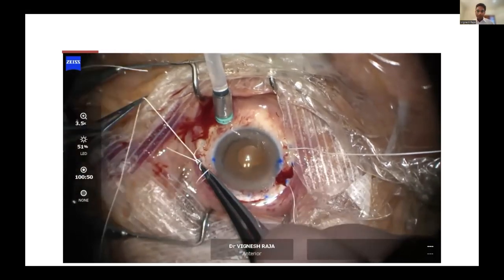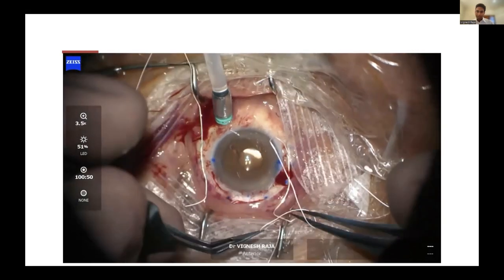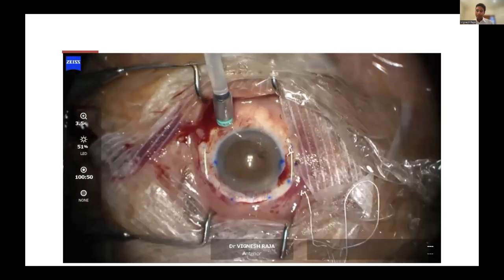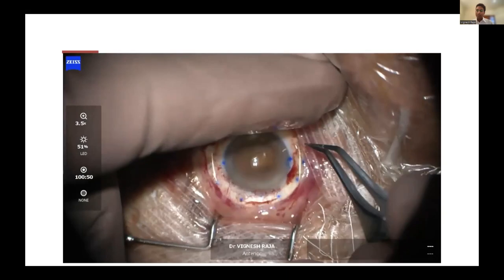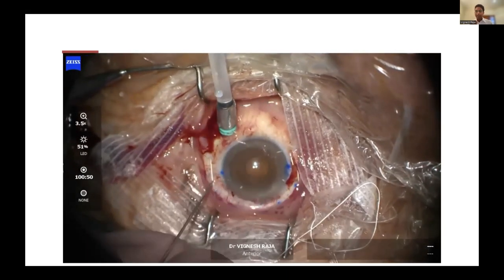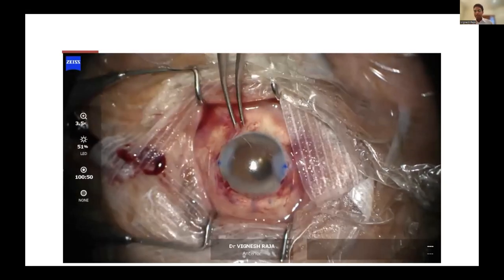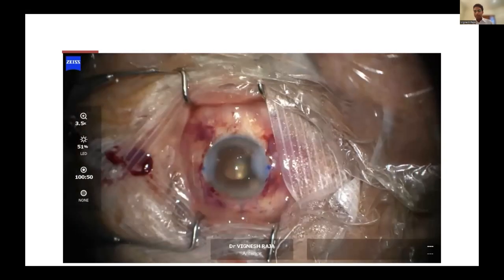The critique that I would give myself with this case is maybe I shouldn't have gone 3 millimeters. I should have gone 2 millimeters, because then it would look exactly like the normal iris. Because I went 3, I had to pull the sutures a bit tight. When you look at this patient on the slit lamp, you can see that there is a gap between his normal iris and the pupil: the normal iris, the remnants, and the artificial pupil. And here I've again used glue to stick it down.